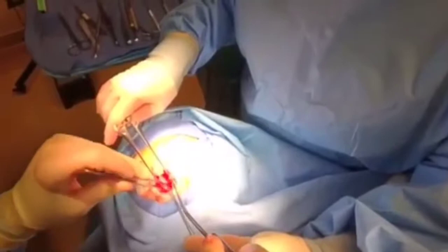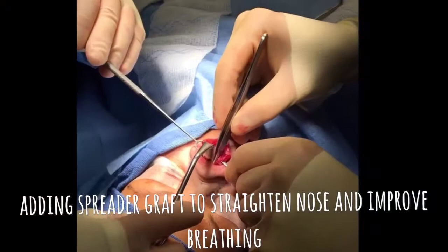Now you have a great view of the septum. We've straightened it out — it was kind of bent over to the patient's left. We freed it up and straightened it out.